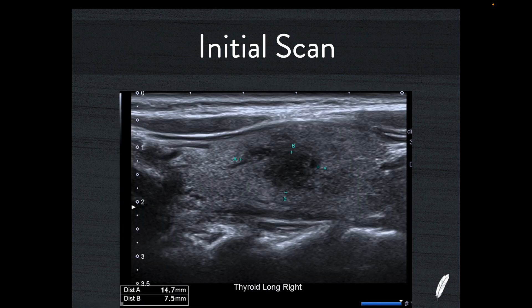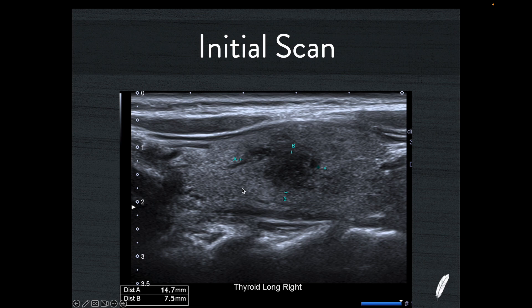If you look at it in the long axis and measure it in that axis, you can see it really doesn't have much in the way of margins — it's quite diffuse. It sort of spreads through the tissue and doesn't really have a nice capsule that you can measure. While certainly papillary cancers can have irregular speculated margins when they blend into the background tissue, this makes me think that perhaps this is a thyroiditis.